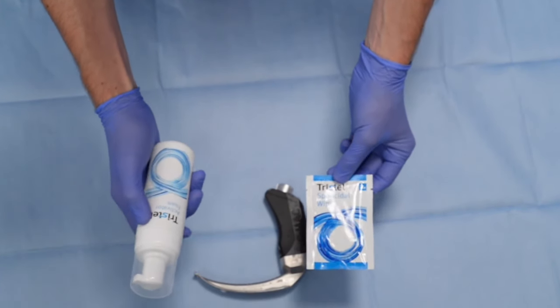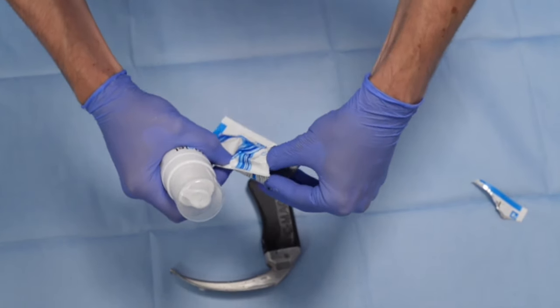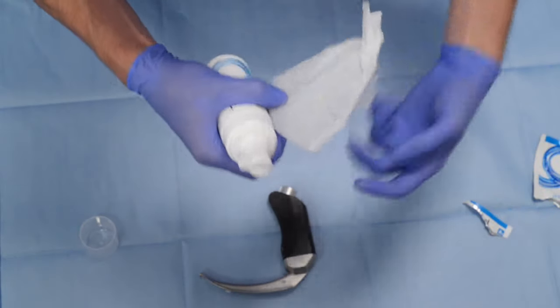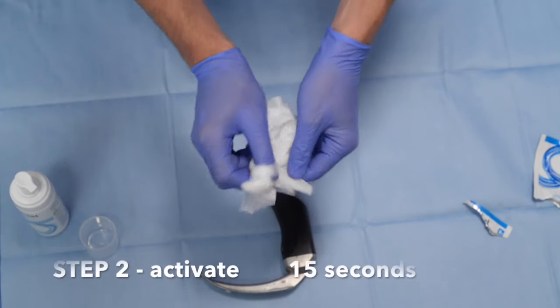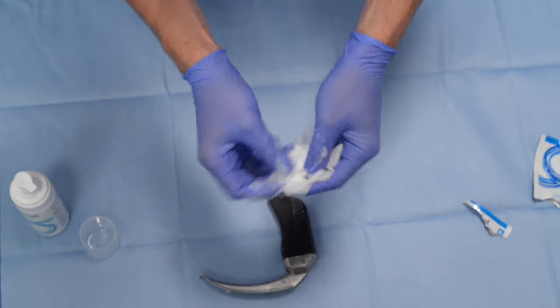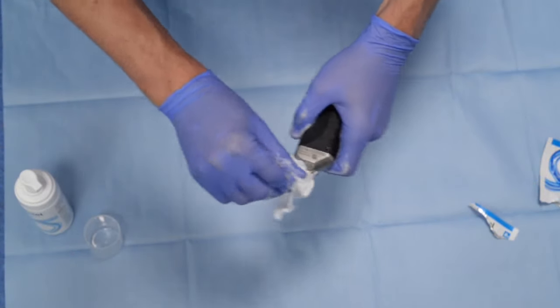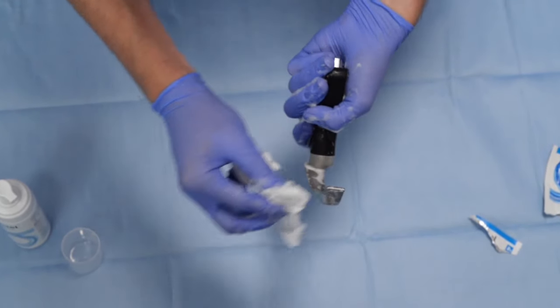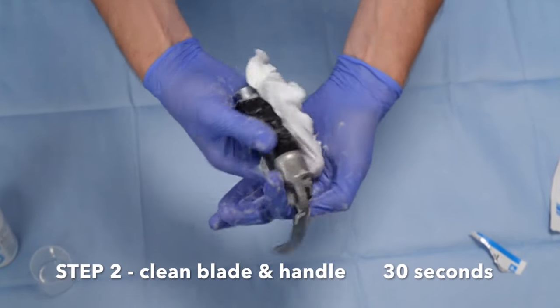Step 2 involves the activator foam and wipe 2A. Take the wipe, add three squirts, and activate the mixture for 15 seconds, making sure it's all spread. Then proceed to carefully wipe the rest of the blade. Do this for 30 seconds.